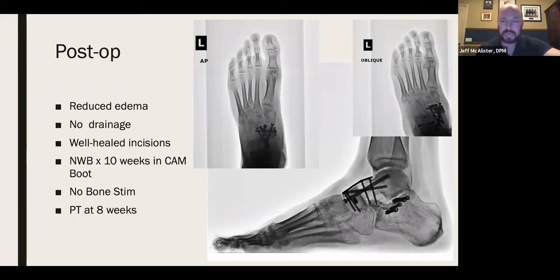We did this stepwise, I guess you could say. What we did first was the calc, obviously. Then we built out and refashioned a new navicular. After we cut the femoral head on the back table, we spackled both sides of it with our Nanobone, and then fixated it to the lateral portion of the navicular. You can see that, rebuilding that navicular and then affixing that to the talus. So that was our ORIF, midfoot dislocation, navicular fracture, and TN joint all combined, kind of like a Lisfranc fracture dislocation.